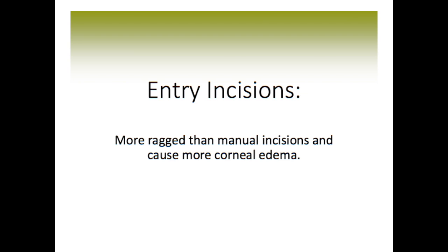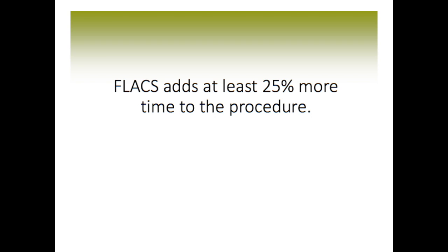As for making the entry incision with the laser, they are more ragged than the manual incisions, just like the capsular edge openings made by it. And as we discussed, it creates more corneal edema. The FLACS technique also adds at least 25% more time to the procedure.